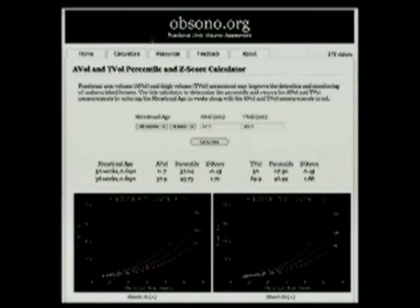This is an example of the online calculator where you enter the menstrual age in weeks and days, and then you type in the A-vol or T-vol measurement and say calculate, and it gives you a z-score or percentile and graphs one or more measurements for each parameter.